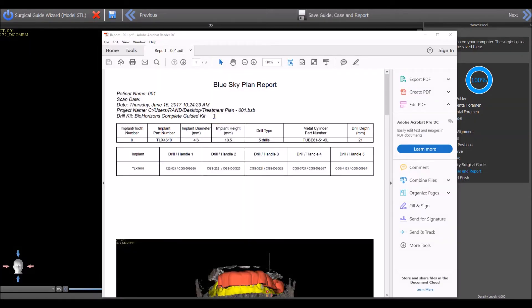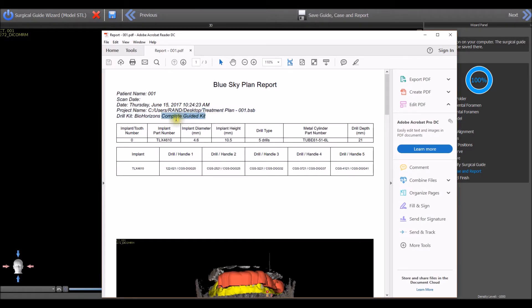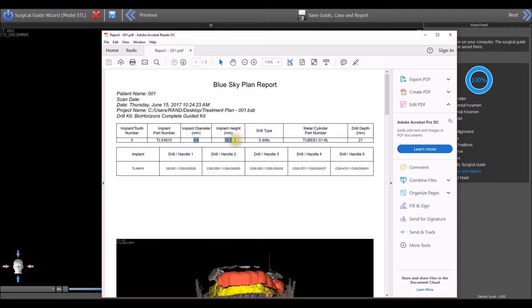The drilling report will indicate the guided surgical kit that was selected and will indicate the manufacturer's implant part ID, implant dimensions, and the metal cylinder sold by BlueSkyBio that will work with the surgical guide.